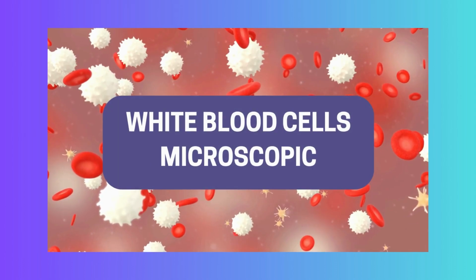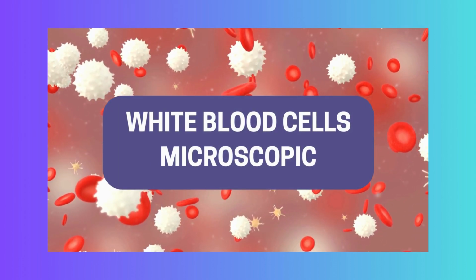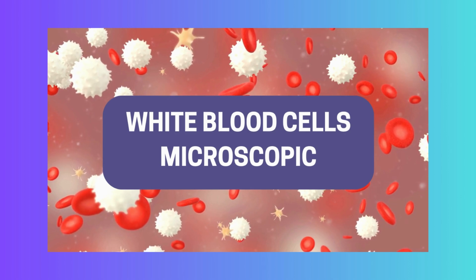How can you pick out the different types of white blood cells when looking through a microscope? They each have some visual clues that will help you identify them.